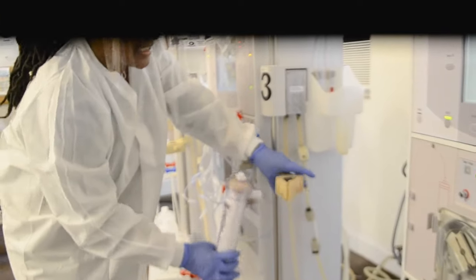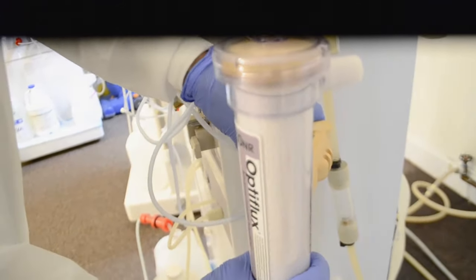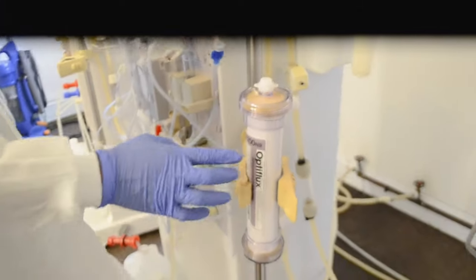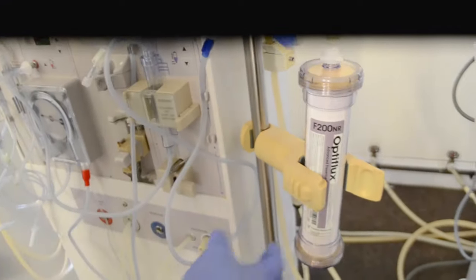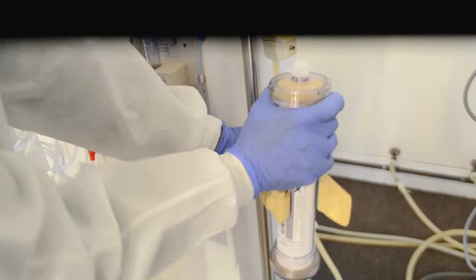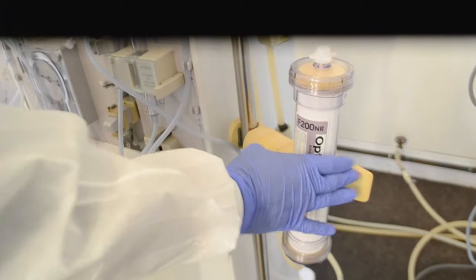There is sort of a lip on here, so my finger is not going to go there. I'm going to use the dialyzer, push that back, and then put it in. I also want to make sure that the label is facing out and is not obscured — as anyone passes alongside the patient's machine, you want to make sure they can read the label on the dialyzer. My dialyzer is now attached.